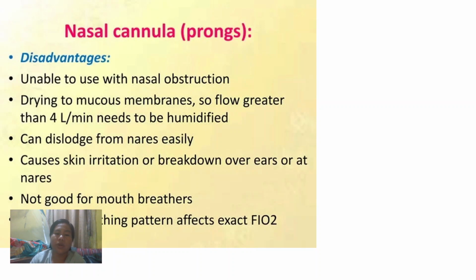Causes skin irritation or breakdown over ears or at nares. Not good for mouth breathers. Patient's breathing pattern affects exact concentration.